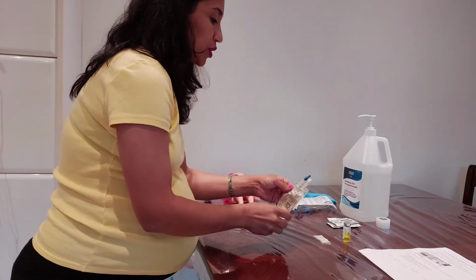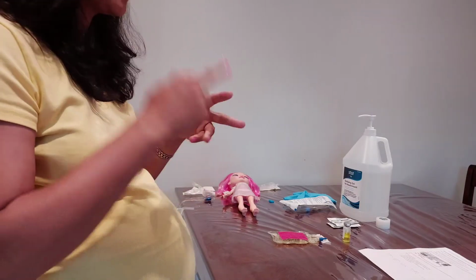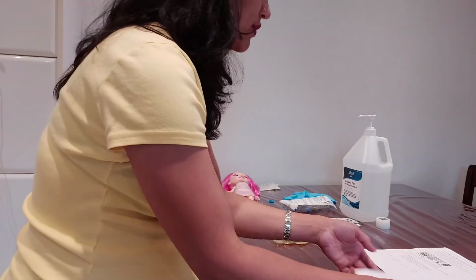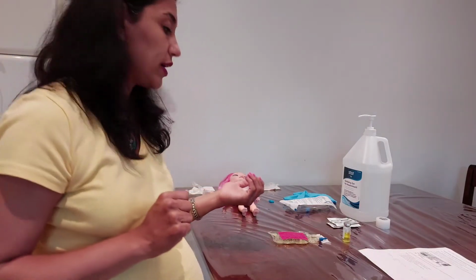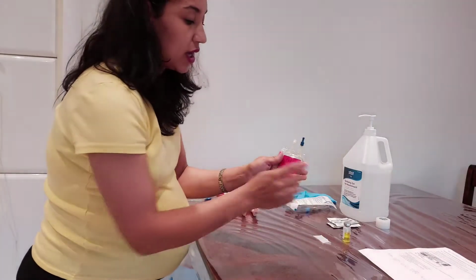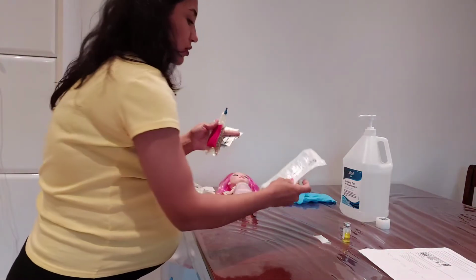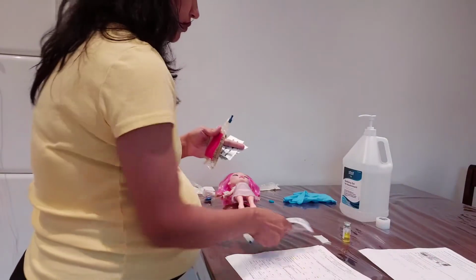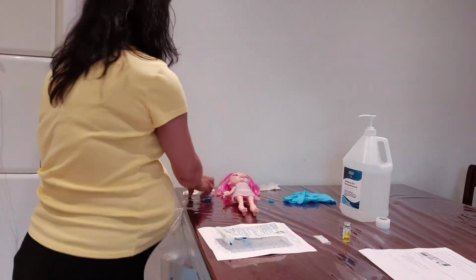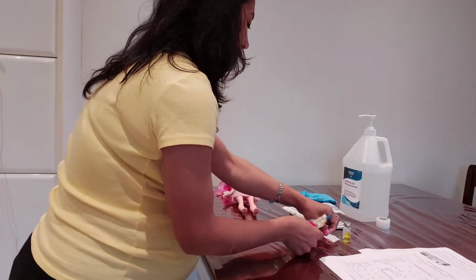So up to now I checked twice everything: the medication, the right dose, the right name of the patient, and made sure everything is okay. Now I have to go into the patient's room and do the rest of the procedure. I have to carry the mini bag, alcohol, secondary line, and MAR. I have to go to the patient's room now.